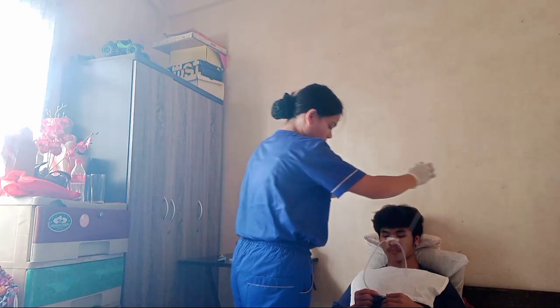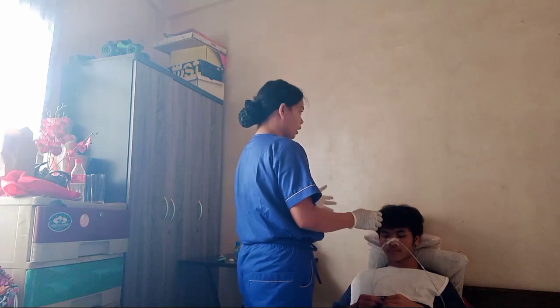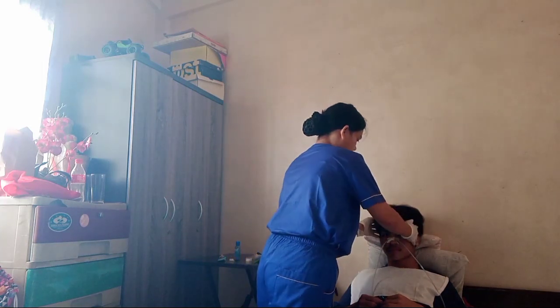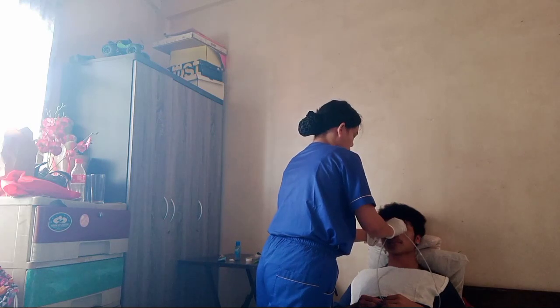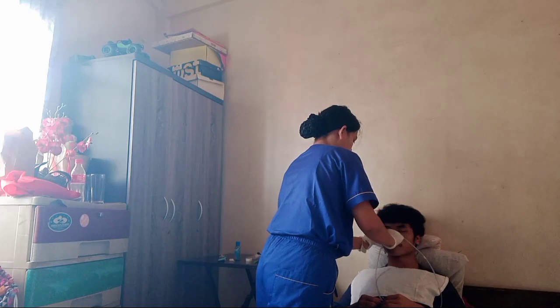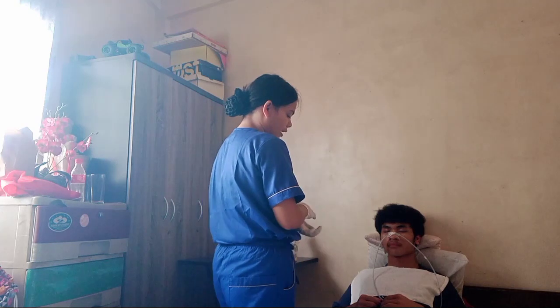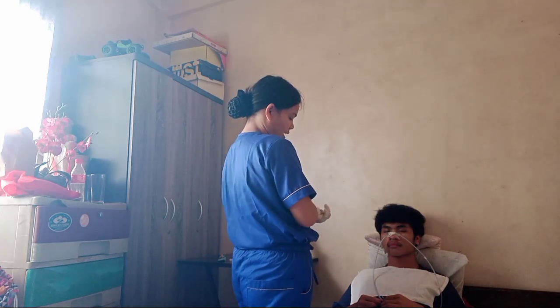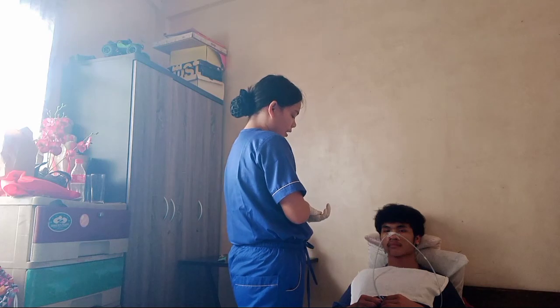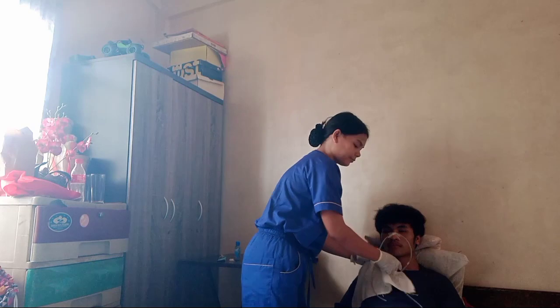Then after that, keep the client's head elevated for 20 to 30 minutes. And after that, rinse the bag and tubing with warm water whenever feedings are interrupted. Then, dispose of supplies and perform hand hygiene. And document the feed hang and flush amount.